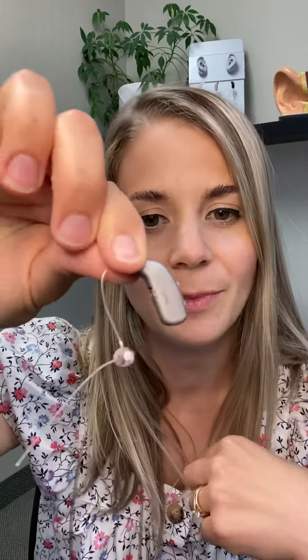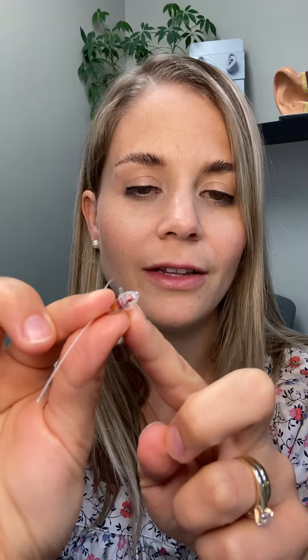The hearing aid I'll be using as my example today is an Oticon Open S receiver-in-the-ear. This hearing aid is designed for my right ear, and I know that because there is red on the earpiece and also red on the back side of the hearing aid. In audiology, red means right and blue means left.